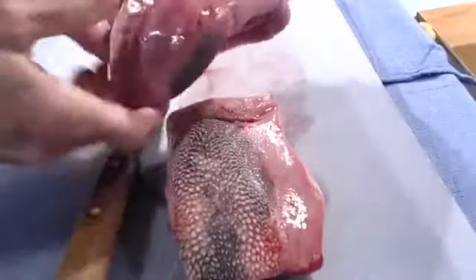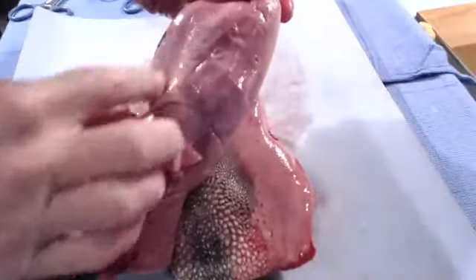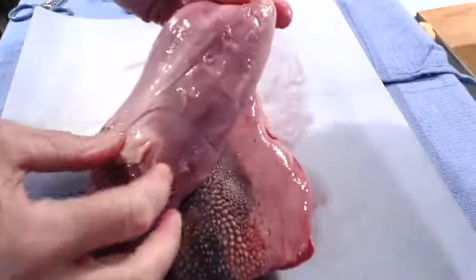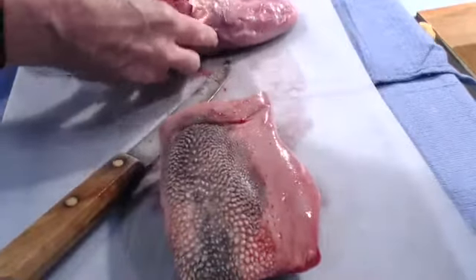So this end of the tongue that has the tip on it we can use to make models of labia and to practice subcuticular closures because it has this skin on this side that is useful for that. I'm not going to make that model right now so we're just going to set that aside.